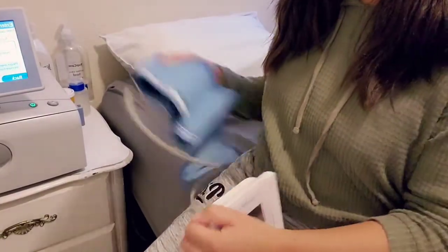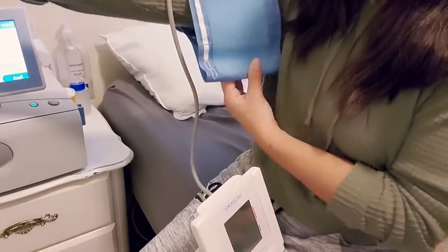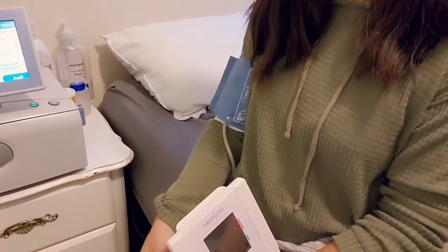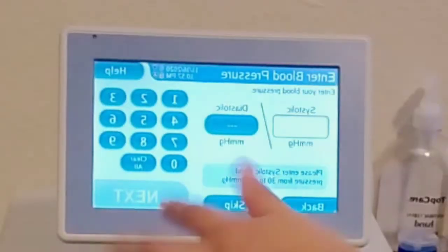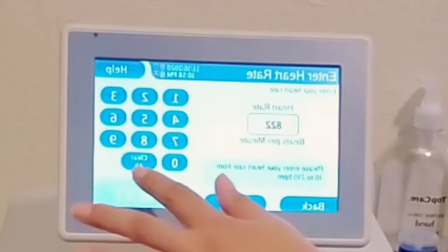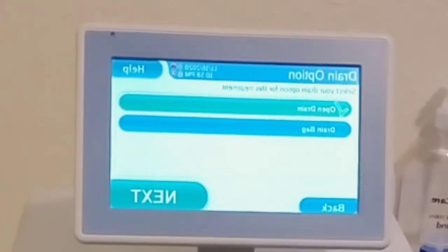Now I'm going to take my blood pressure. I'll aim the cuff at this arm, make sure the wire is in the middle, and tighten it — not too tight, but not too loose. Stay still and quiet. I got 114 over 79 with a pulse of 82. I'm going to enter that: 114, 79, next, and then heart rate 82.